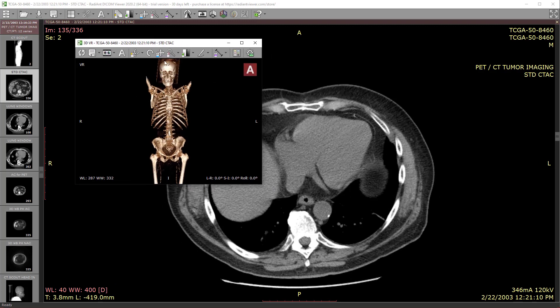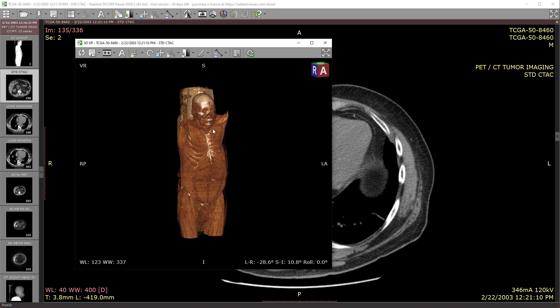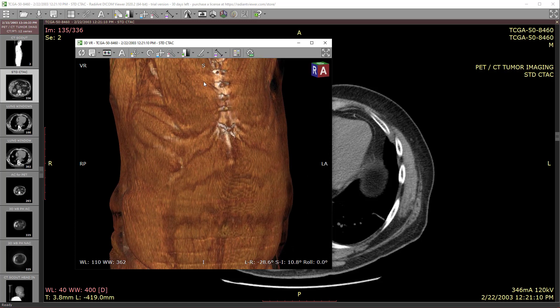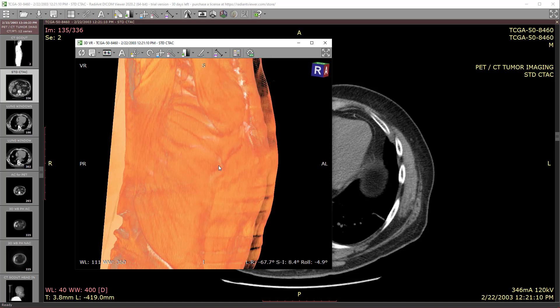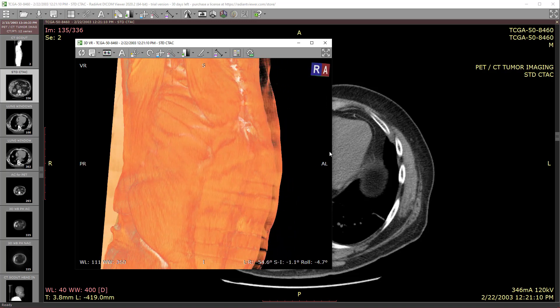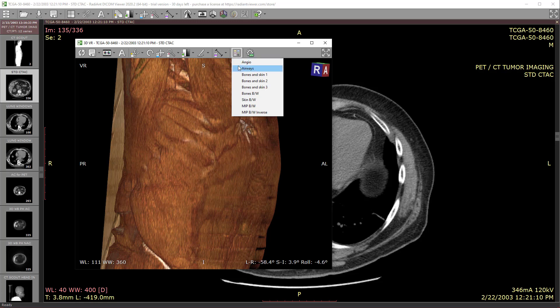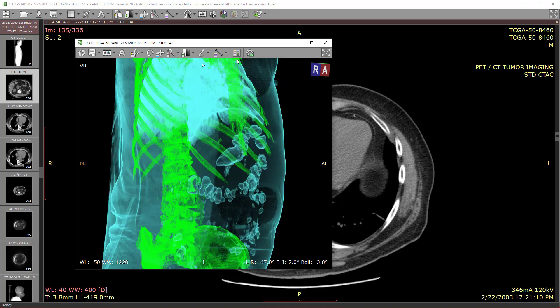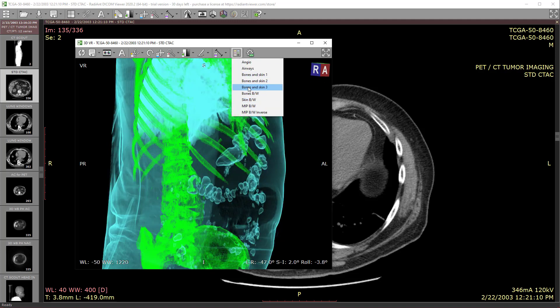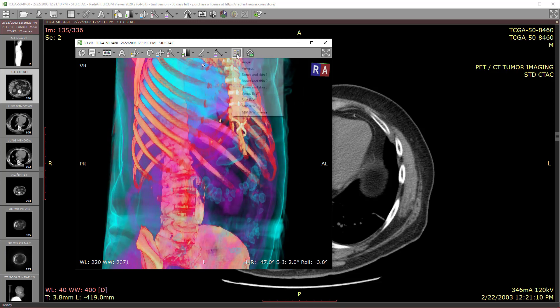Hopping back into the 3D view, here's an even bigger cross-section of the body. You can go into the body and all the way out to the skin, then dive back in again. You can also turn off the shading for possibly an even better look at what's going on inside. There are a couple of different viewing modes including airways, bones, and skin highlighted in all sorts of cool ways to visualize the data. You use the middle mouse button to go through the different layers.